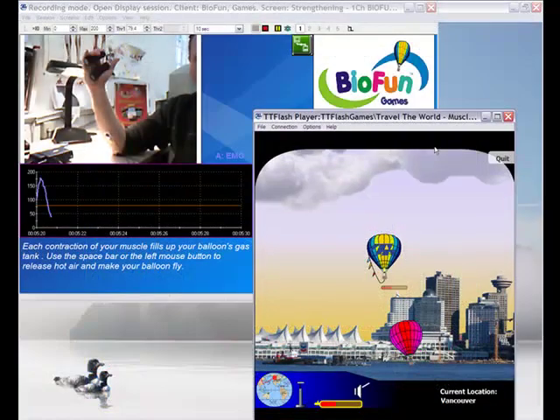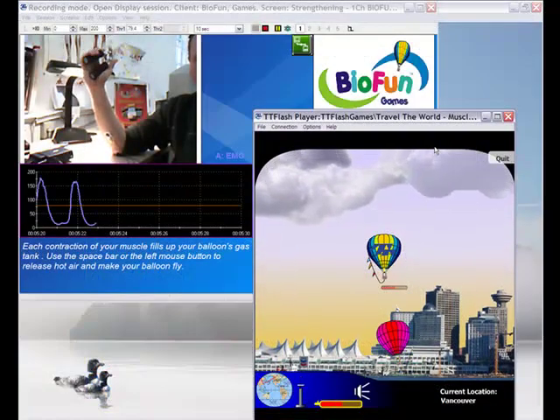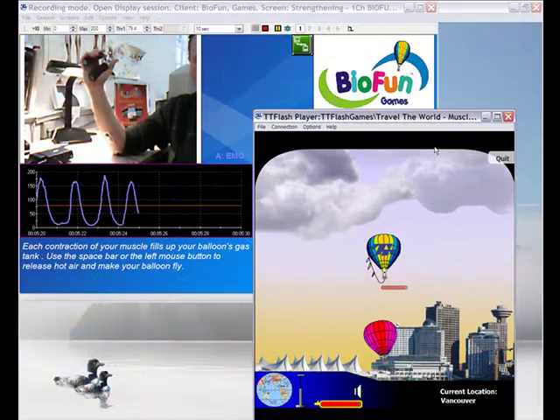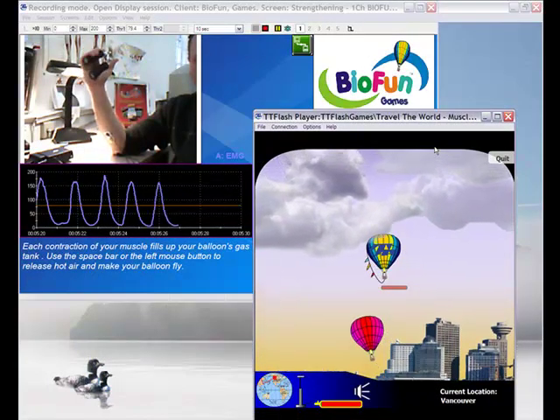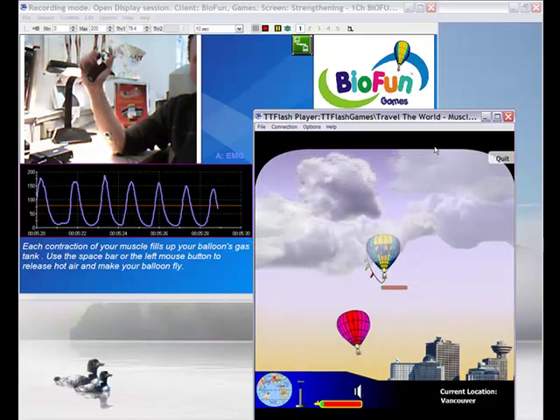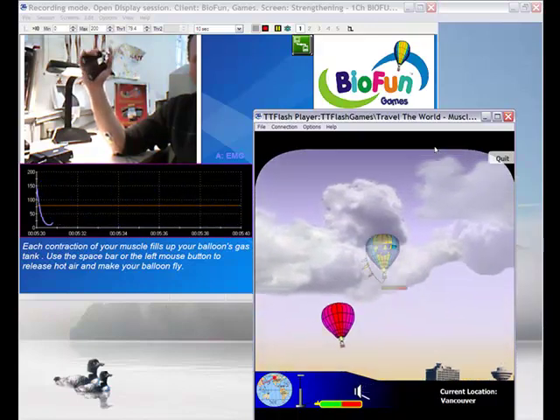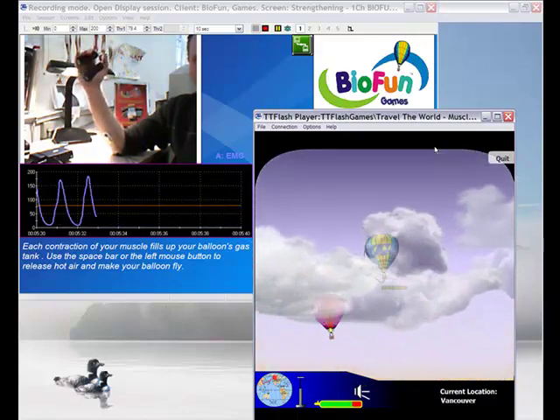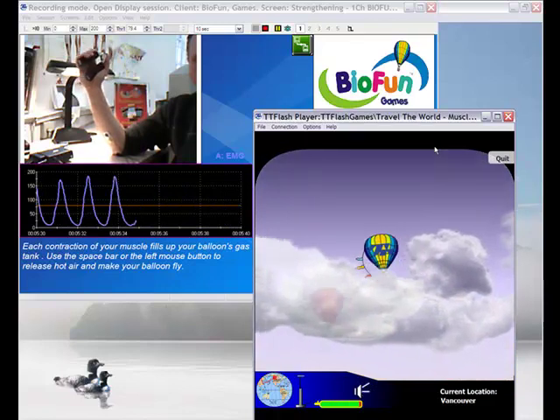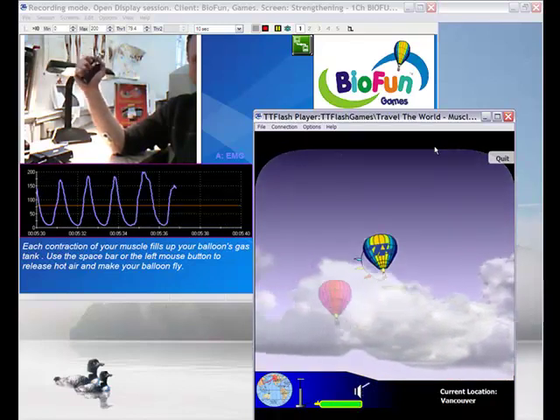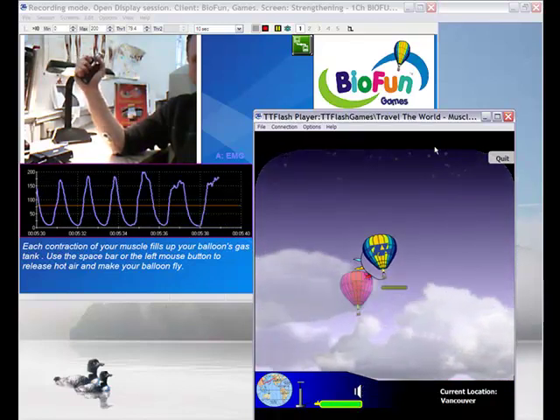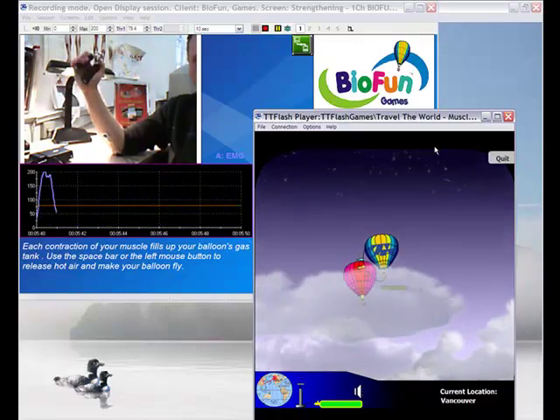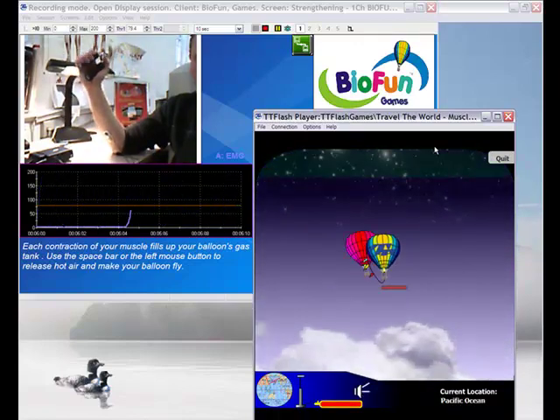Here we go. I'm flying the balloon now. As you can see, I'm squeezing a hand grip. And you see the EMG line, the blue line, going up and down in the line graph. Crossing a threshold, the red line. And it fills up the gas tank of the balloon. And I use that gas to fly the balloon.